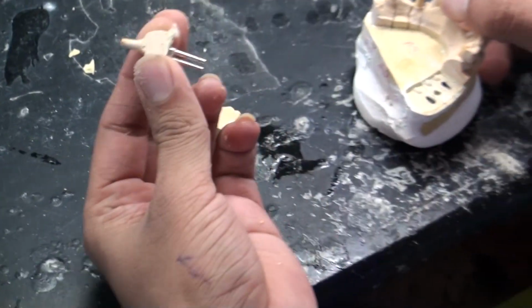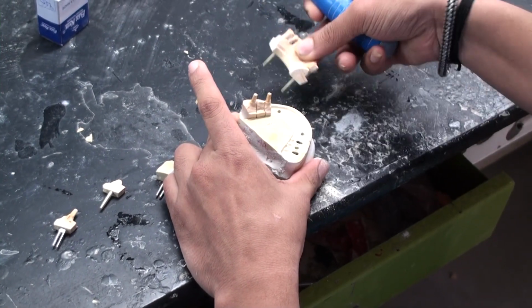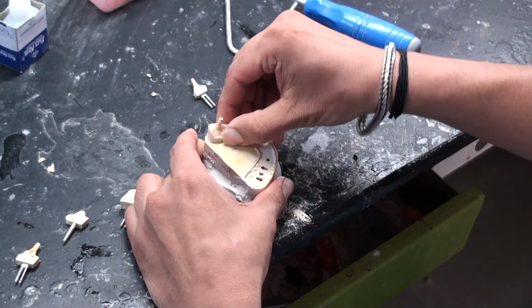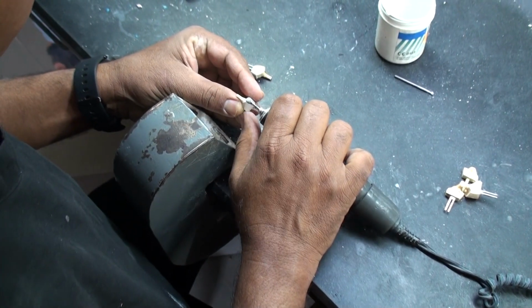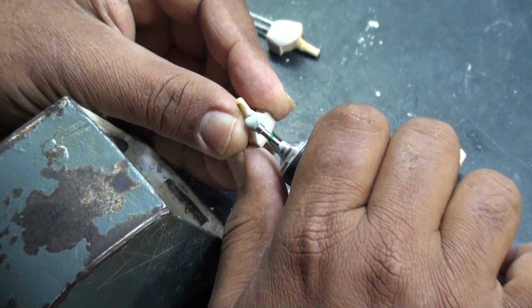He's made all the cuts, and he's starting to pick them off the base, and they fit perfectly back. There's only one position those dies can actually go back on the base, and if you look at the base carefully, you can see the metal inserts are in there. Now this is the next very critical step where he's trying to ditch the models.